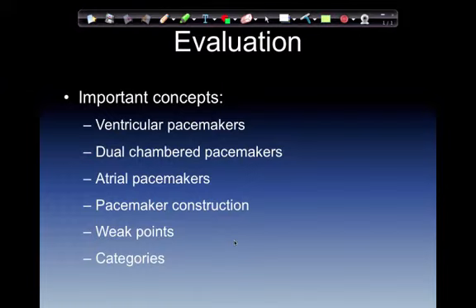Categories as far as pacemakers go, they're going to be ventricular pacemakers, atrial pacemakers, and then dual chamber. Now the dual chamber, even progressively, this has changed as well. So they have both AV sequential and biventricular. Biventricular is if the patient has had an MI in the septal area and the lead in the right ventricle won't be able to depolarize the entire ventricles.